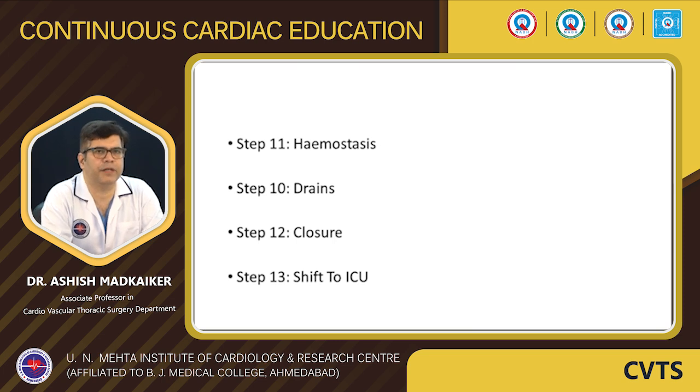Again, it is very important to achieve good hemostasis in cardiac surgery, because one of the things that we should prevent in the post-operative period is blood transfusion and re-exploration. So we should try our best to achieve good hemostasis, drain in appropriate places, stage closure as per the protocol, and then we shift the patient to ICU. This was how we conduct aortic valve surgery conventionally.